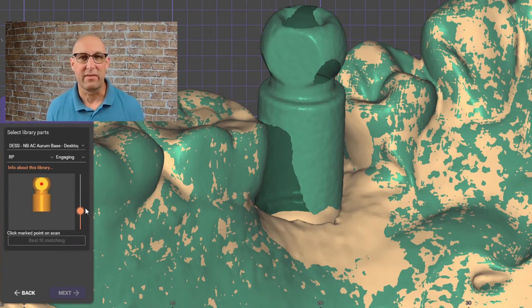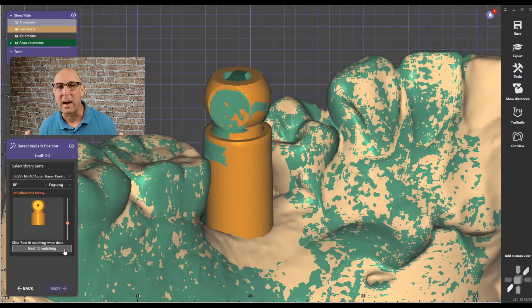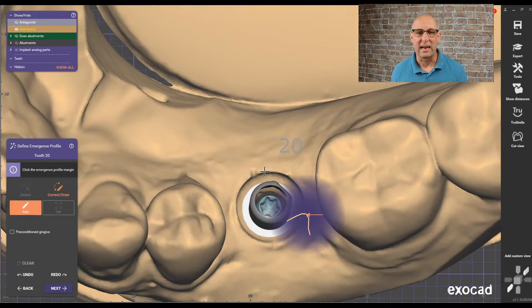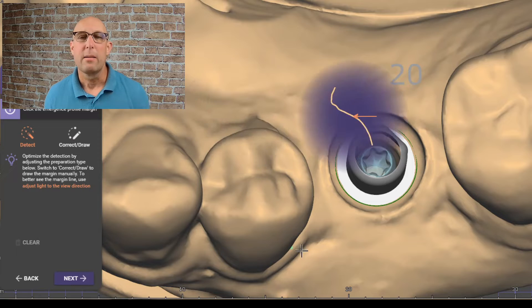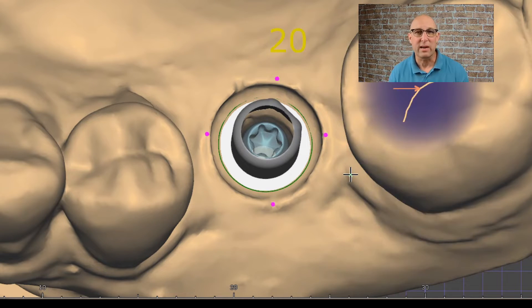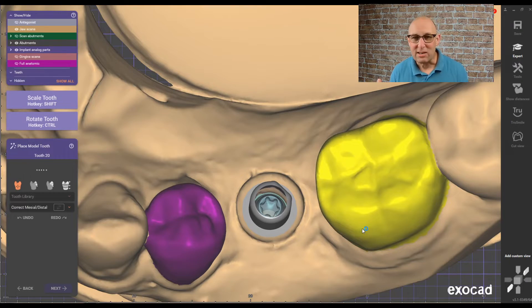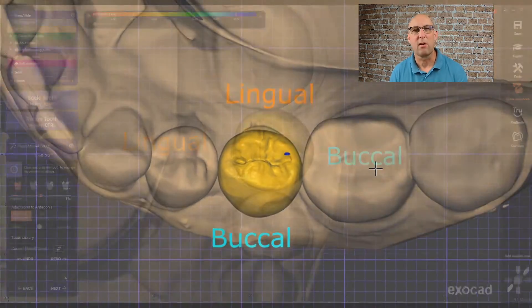This is a really interesting feature — you can play with the size of how Exocad recognizes the scan body, just in case it is very deeply buried into the tissue. That makes alignment much, much better. Click Best Fit Matching and Exocad will align the scan body really nicely. If your clinician did a good job of training the tissue, you can click on pre-conditioning tissue and put four dots around the emergence profile. Exocad will automatically identify the emergence profile. If you click Next, Exocad does a really nice job presenting you with a proposal of the crown design.